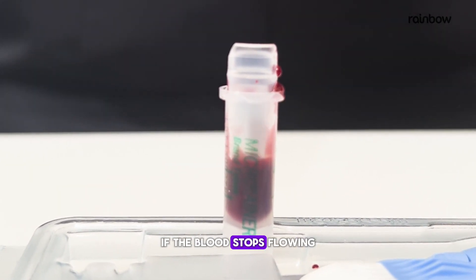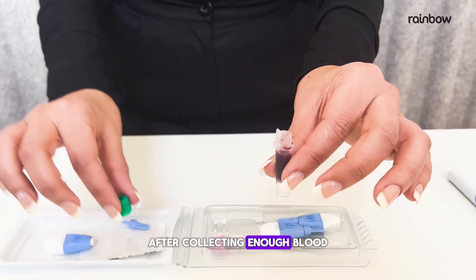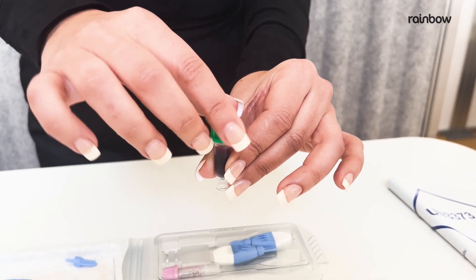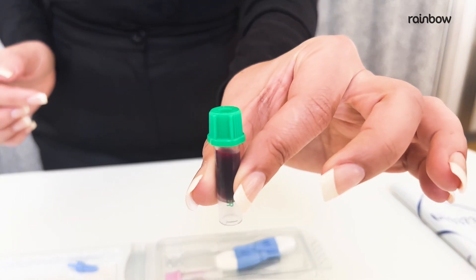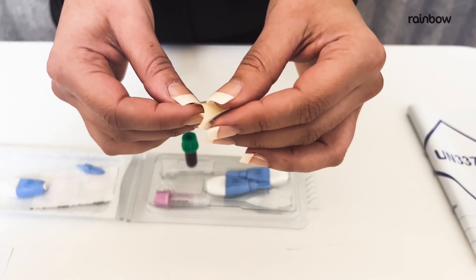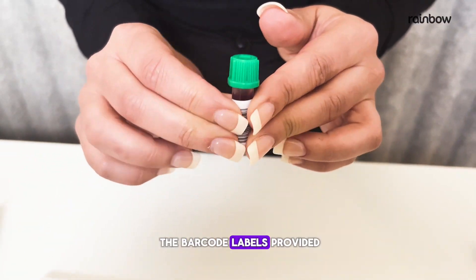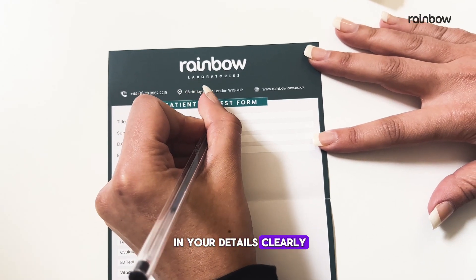If the blood stops flowing, wipe your finger and try again. After collecting enough blood, close the tube with the cap until it clicks. Gently invert the tube to mix the sample. Finally, label your tubes and request form with the barcode labels provided.